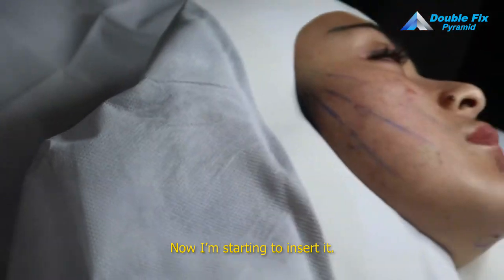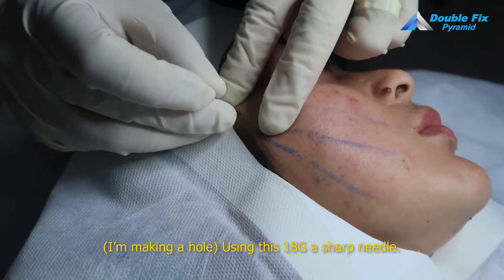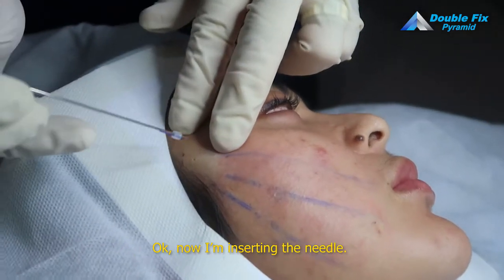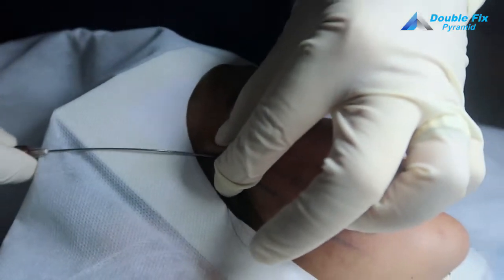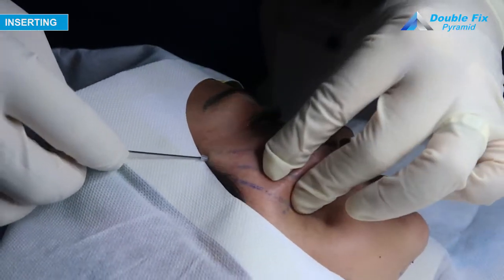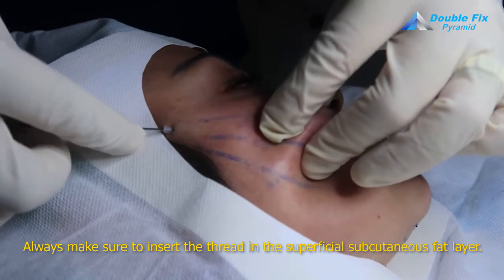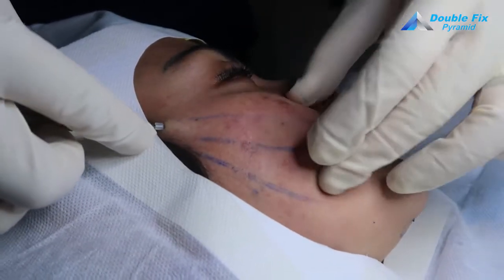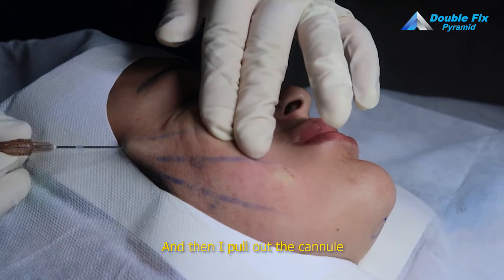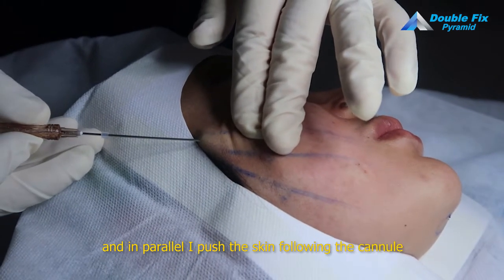Now I am starting to insert it — this is 18G, 18G sharp needle. Always make sure to insert the thread in the superficial subcutaneous fat layer. And then I pull out the cannula, and in parallel I push the skin, following the direction of the cannula.